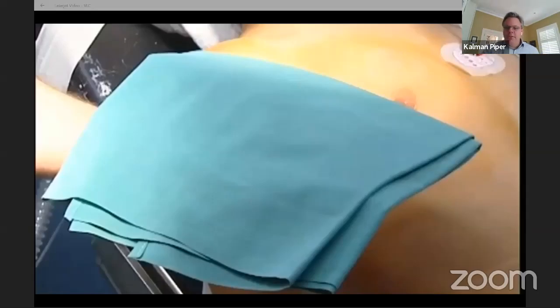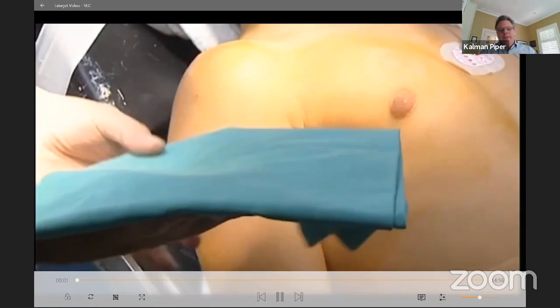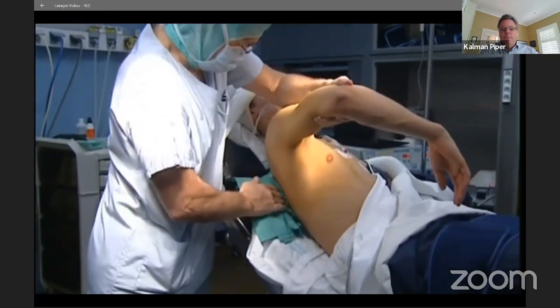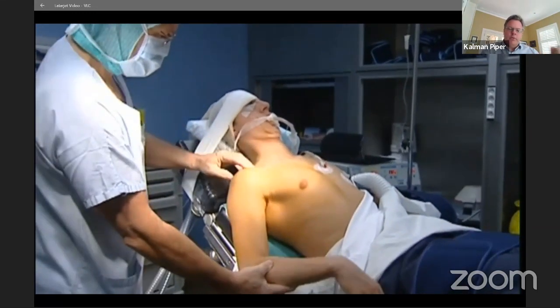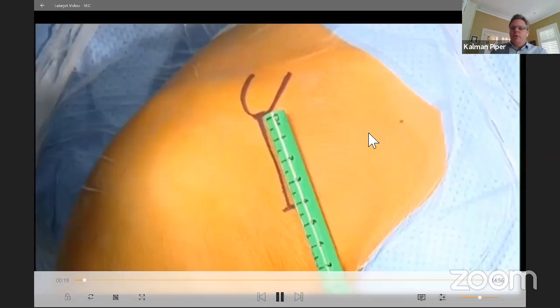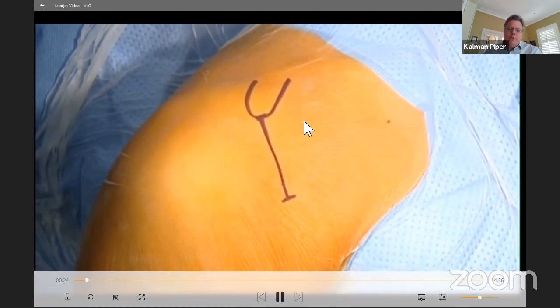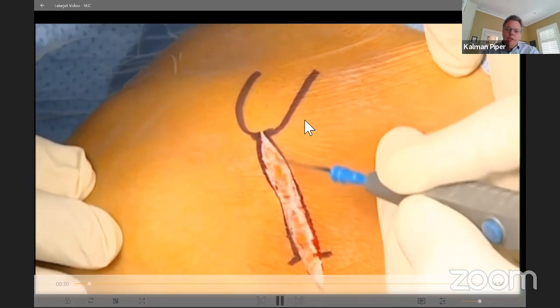So I was interested to hear, Des, that you no longer use a bump behind the shoulder. I might have to try that, but I certainly have been taught and always place a rolled up pillow slip, usually behind the medial border of the scapula, so that the scapula doesn't retract when you've got the intra-articular retractor in, either a Trillat retractor or a Fukuda retractor. And the reason why I now have gone back to doing it open is because I can do it through a fairly small incision, about a 4 centimeter incision, starting at the tip of the coracoid process and extending distally.